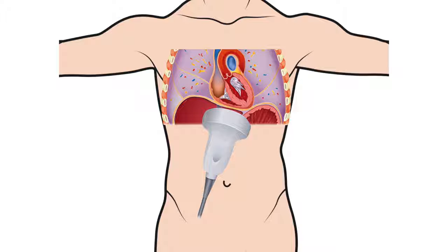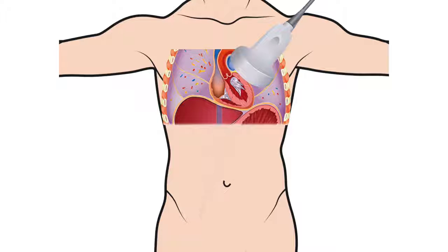If you have a large amount of stomach gas, you see where the probe is located. You can slide towards the patient's right to try and image through the liver and avoid the stomach bubble. However, if there's a lot of bowel gas degrading your view and limiting your window, your other option is to move up onto the chest and obtain a sagittal view of the heart or a parasternal long axis.